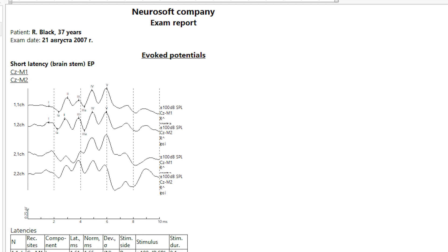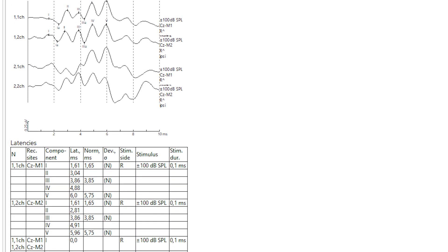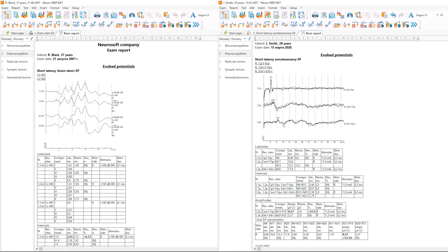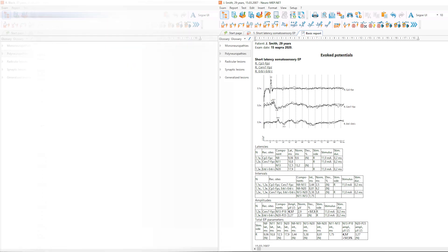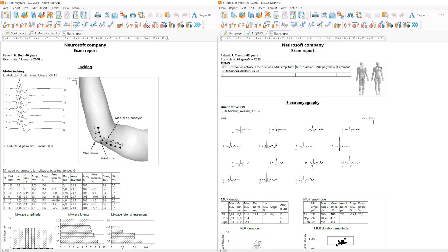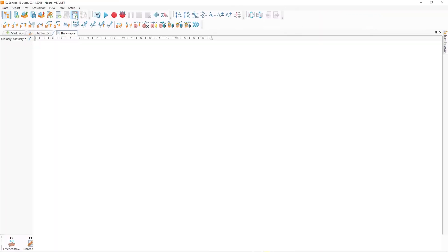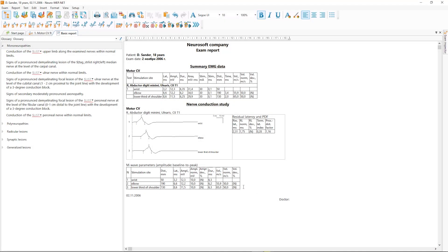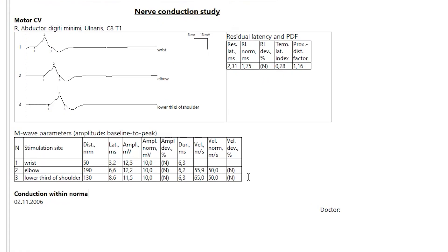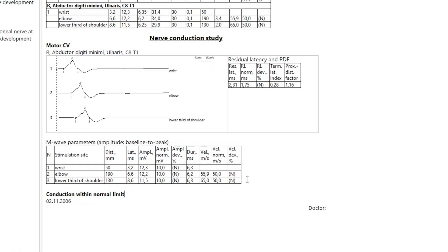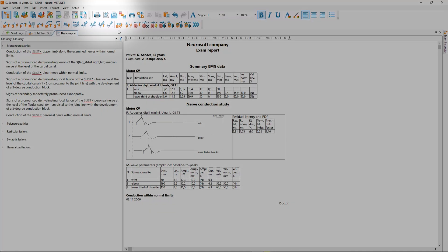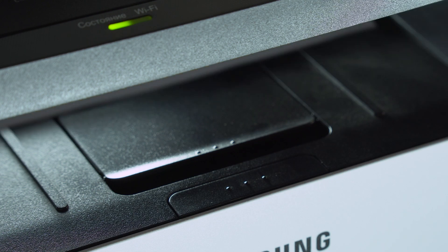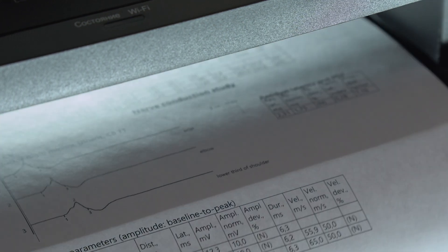After the examination is completed, the software generates the report automatically. It includes the results of all tests performed as well as the graphs, traces and tables with obtained values. You can edit the report or customize its view when necessary and print it directly from the software.